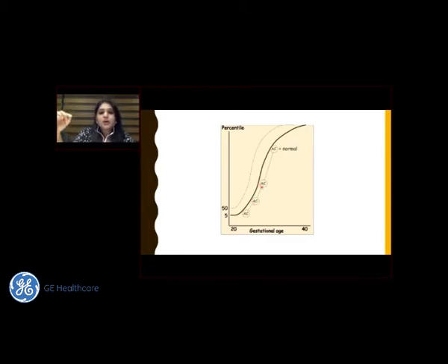And you do not need to go in and manually chart this, but your ultrasound machine and your softwares do it for you. Okay, so can you see how beautifully the abdominal circumference has maintained its growth curve along this 5th centile? Okay, so this is probably either a constitutionally small or a healthy small fetus, or probably this is a delayed conception which has not been dated, and therefore it is being seen below the 5th centile but growing beautifully.